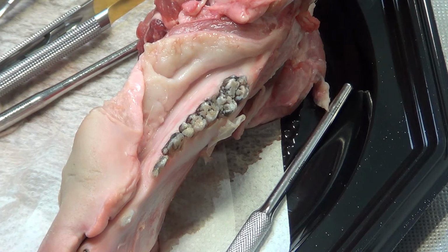So the 3 incisions are perpendicular to the long axis of the tooth, but then to elevate the flap, you need to go parallel to the bone. If you don't go parallel to the bone with the blade, you eliminate the periosteum and everything is done. You cannot close the flap because you have no possibility to obtain new keratinized tissue. Perfect. And then go parallel to the tooth. Perfectly. Exactly.